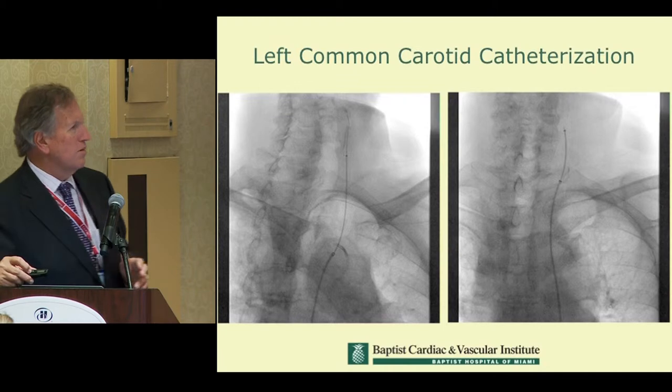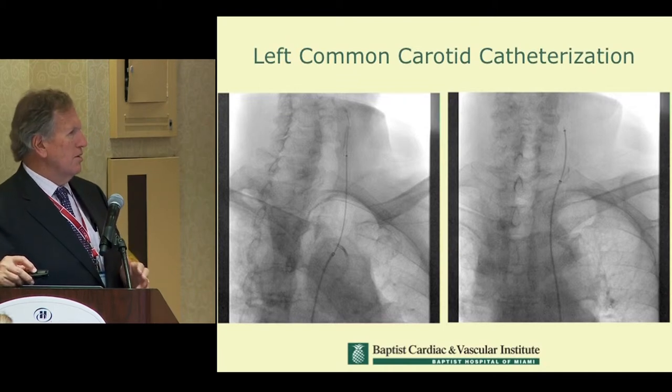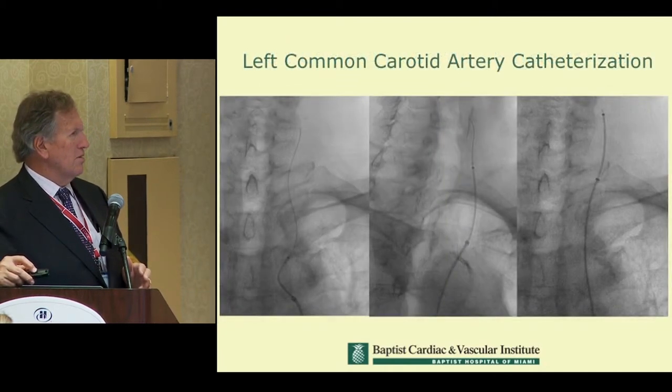This is a carotid stent done from the left side. Here you can see driving the catheter — this is the sheath, this is the catheter, this is the wire up in position. You can see the level of opacity and control throughout the procedure.